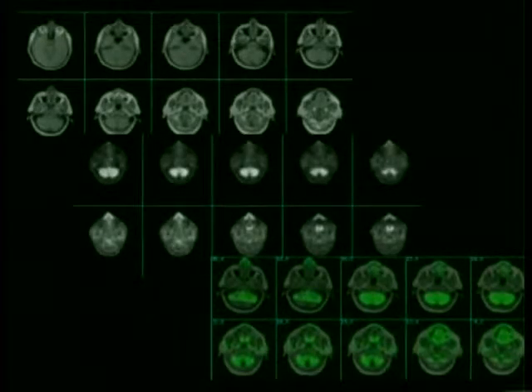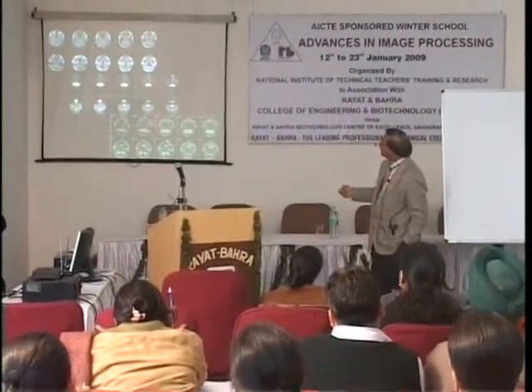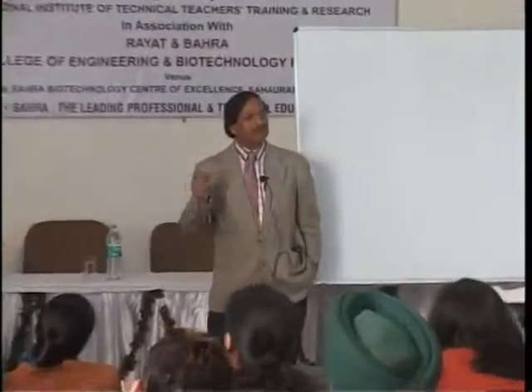This is an MR study, and this is a PET study. You can fuse it. You can even delineate the abnormality, or you could pick up the uptake from the abnormality. Next. Next.